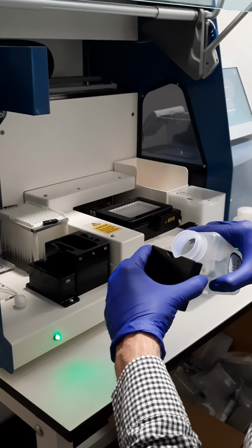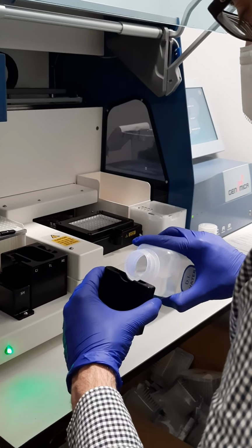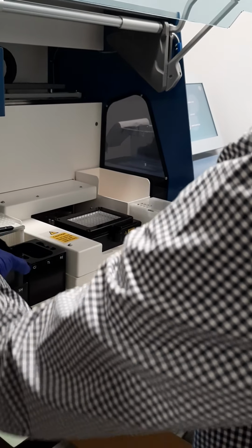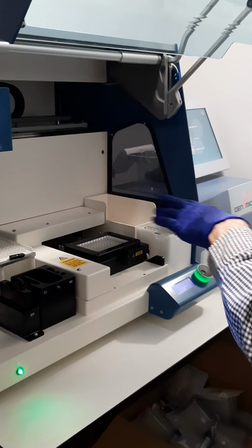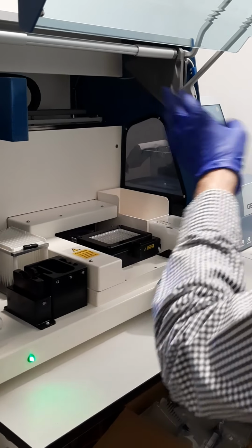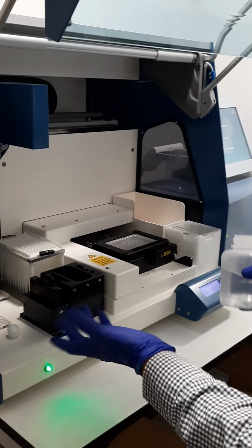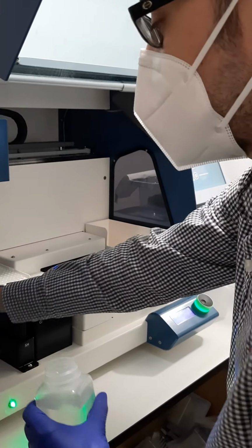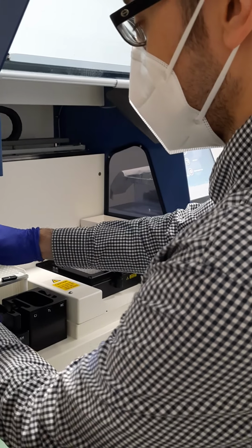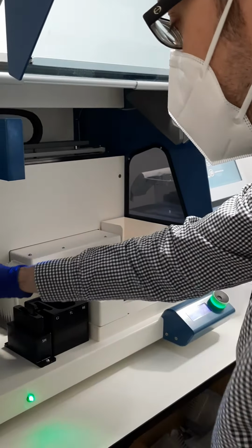Just reading. Just to wash the machine now? No, the machine now is going to do an operational qualification, but it's a procedure to check that everything works well, the pumps are taking the volumes. We are not going to use real reagents, it's just to perform the operation, the test. Like a functioning check, exactly.